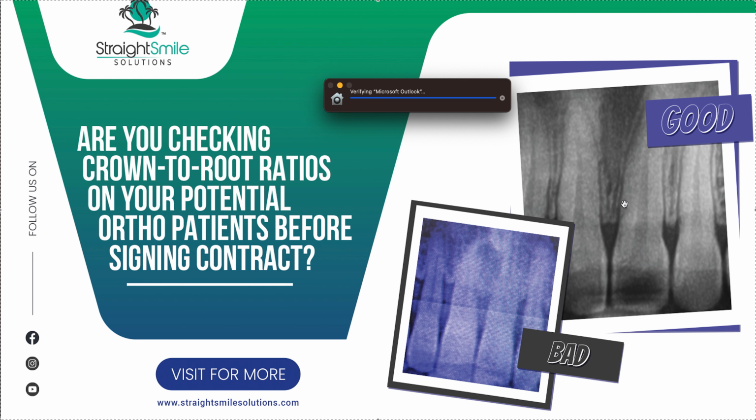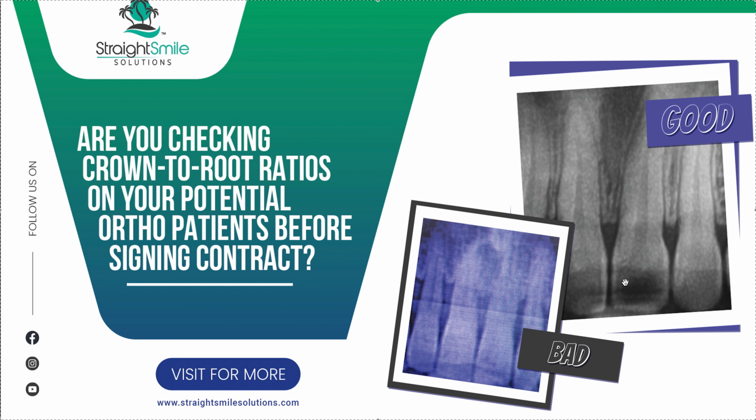So let's say the length of the entire tooth, I don't even know how long an incisor is, it's definitely 2 centimeters, I don't know. I want to see at least 50% of it covered by bone, which it is here. So 50% would be here. We've got more than 50%, this is good. We've got less than 50% here. I would say 2/3 doesn't have bone and 1/3 has bone, or even worse, possibly 25%. Bad.